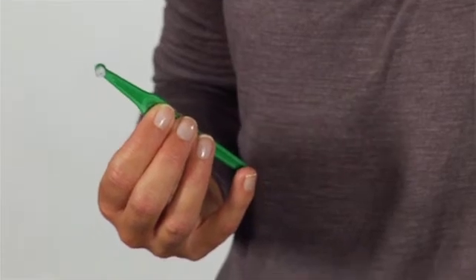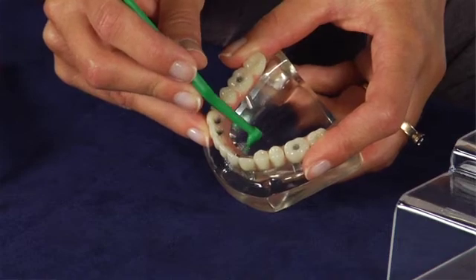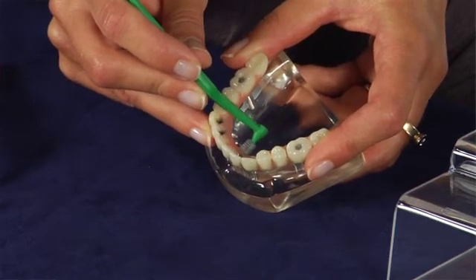In the back of the mouth, or if you clean from the inside, it can be easier with an angled interdental brush. For this, we offer TP Angle.